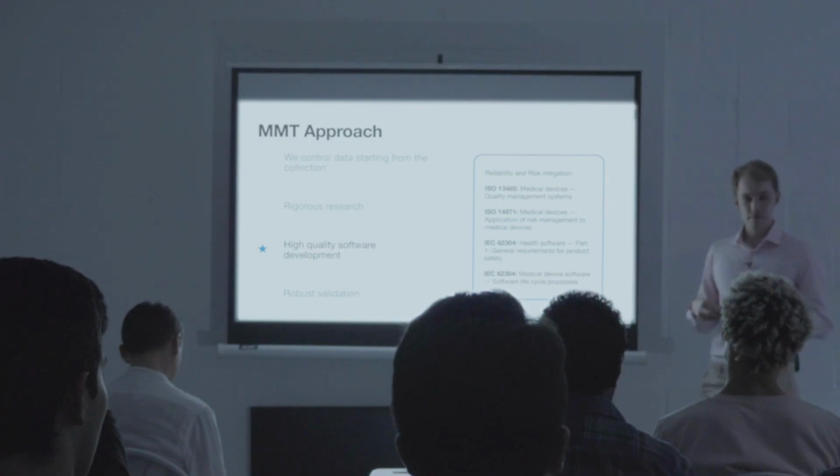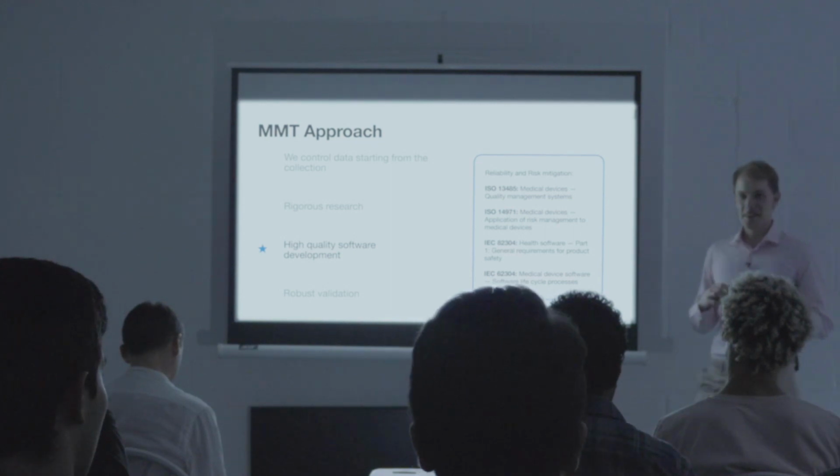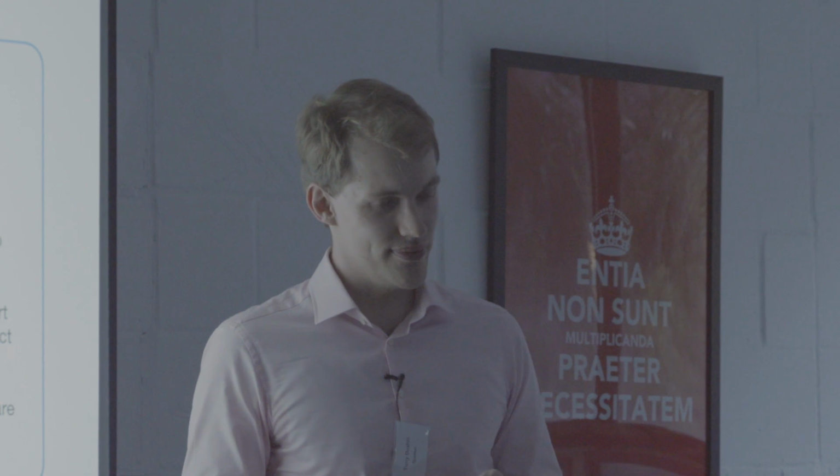And do you target 510K or de novo, or does it depend? There are different complexities, depending on your device and its intended use. You might want 510K, which is much easier, or de novo. We decide for each particular device in each particular case.